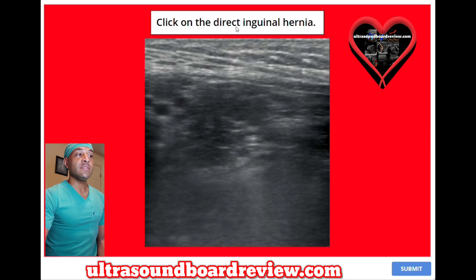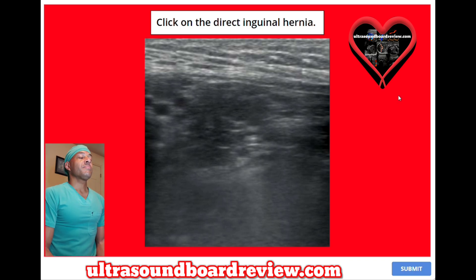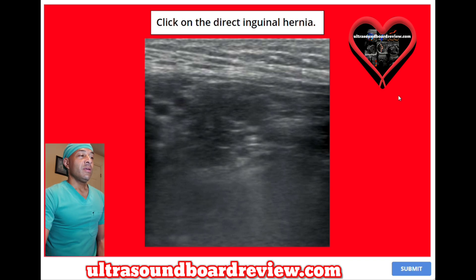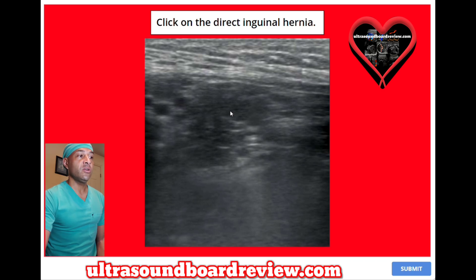Click on the direct inguinal hernia. This right here is the hernia. This is the direct inguinal hernia.